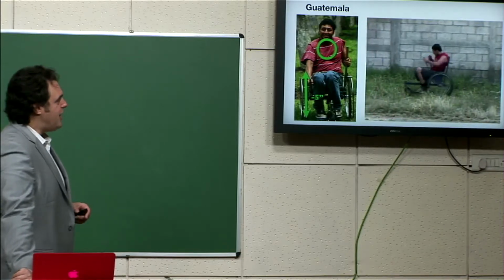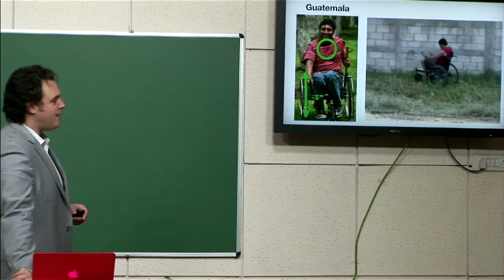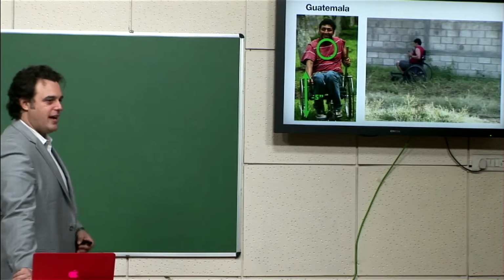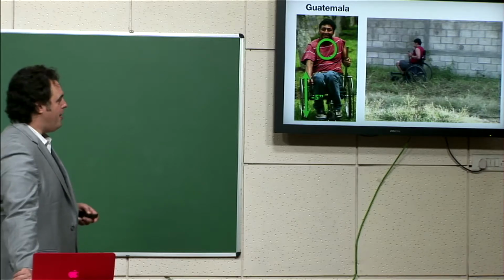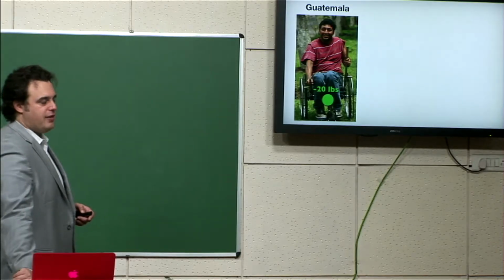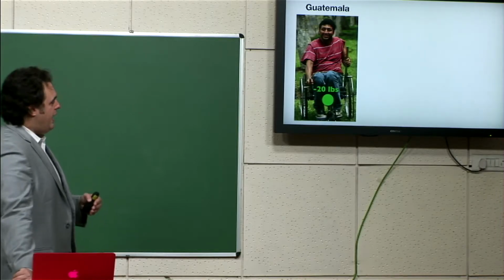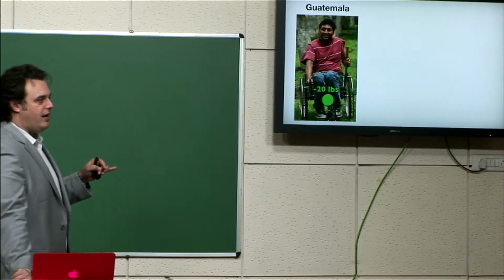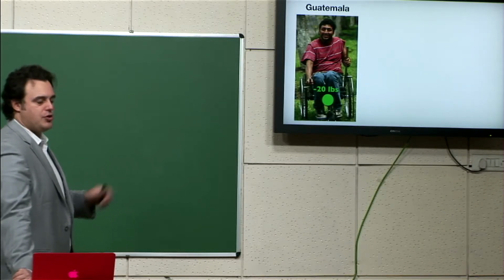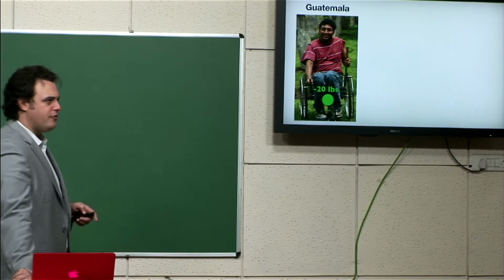And then here's that back pad. See him pushing and the force reacting at that back pad so his back doesn't bend backwards. This guy has a spinal cord injury. He has no control of his abdomen. And so that little back pad made a massive difference. And then also we were able to remove 20 pounds out of the weight of the chair by just, again, being very judicious about where we use steel. And this chair weighed 47 pounds, which was almost exactly what the competitor chairs were on the market. So it was the same weight, even though it had 11 to 12 pounds of drivetrain weight.